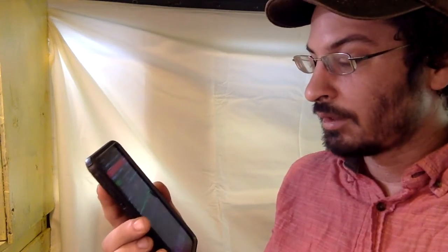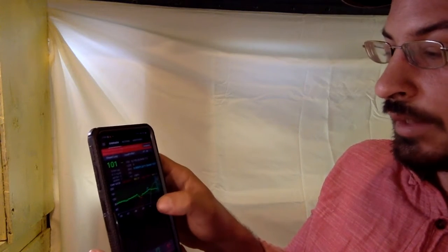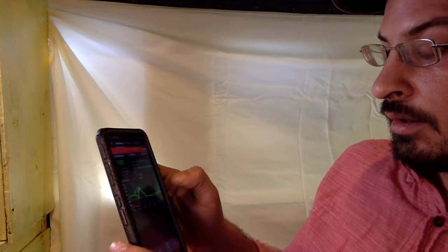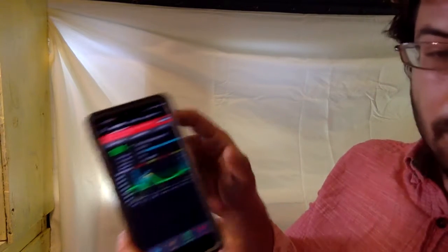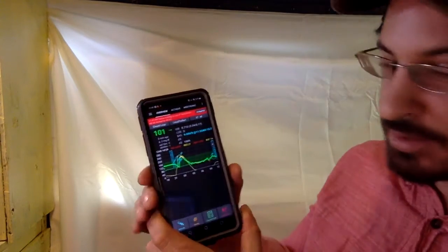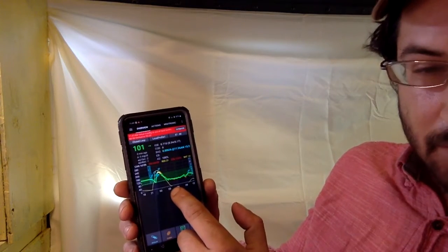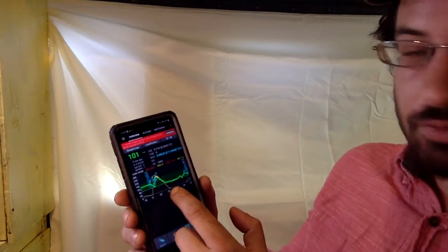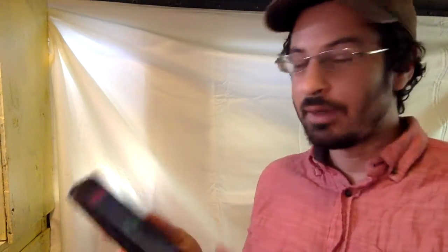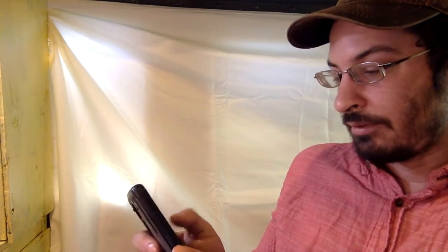Okay, there's that error I was talking about. Well, let me talk about the action first. So this action starts when I enter that insulin into the system. So I can see, when my blood sugar was high, kind of a cool curve. That insulin matches the curve of the blood sugar spike really well. But that insulin was having an impact all the way to here. So if you're going to go eat, but the activity line is really high, you have a lot of insulin on board in your system, you should be mindful of that.